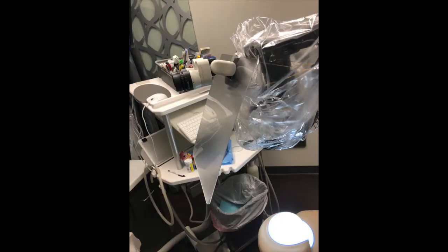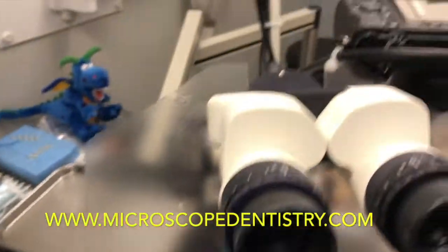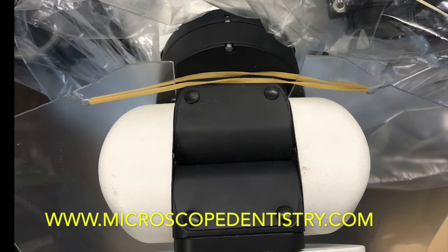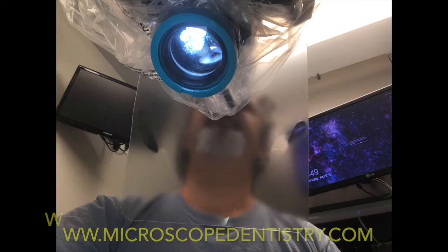A thin piece of plexiglass can be easily mounted onto the microscope to provide a large shield. This will slip onto the microscope and is easily retained with a rubber band. The view from the operating field shows a large shield area protecting the dentist.